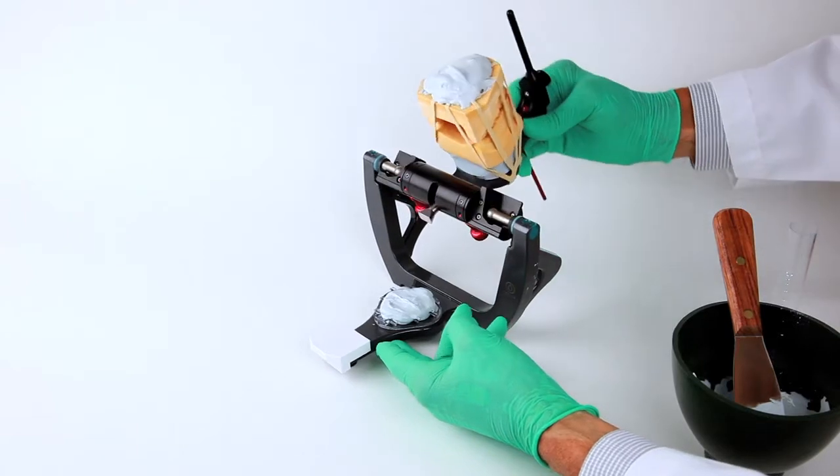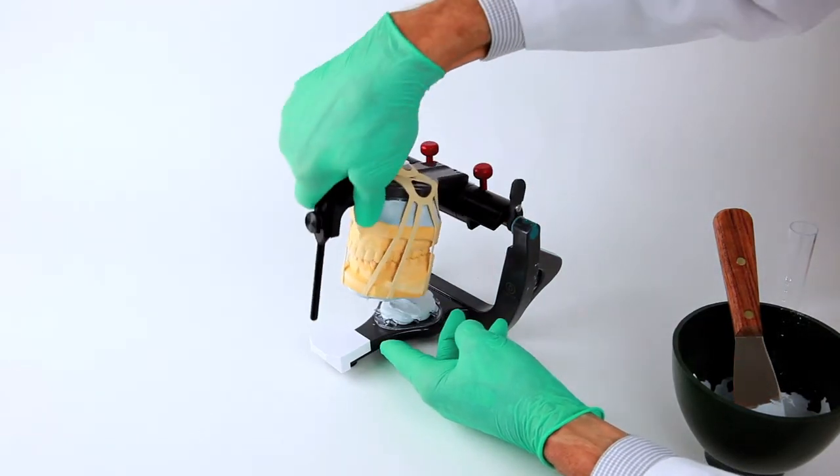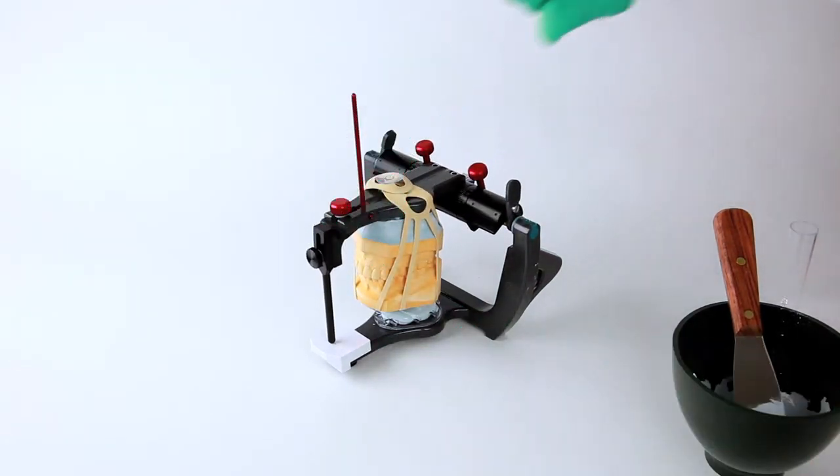Once an adequate amount of mounting stone is in place, the articulator arm is then closed. Light tapping on the upper articulator arm is recommended to make sure the incisal pin is seated on the incisal guide table. At this point, the articulator can be left as is for the stone to set or it can be inverted or whichever is desired.